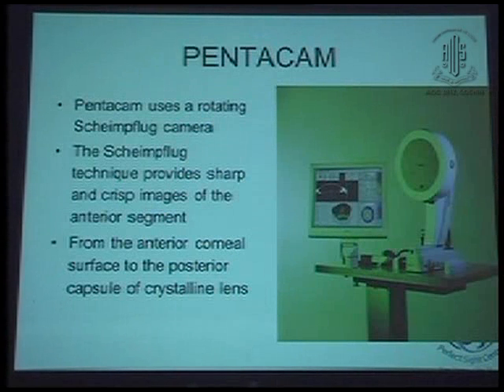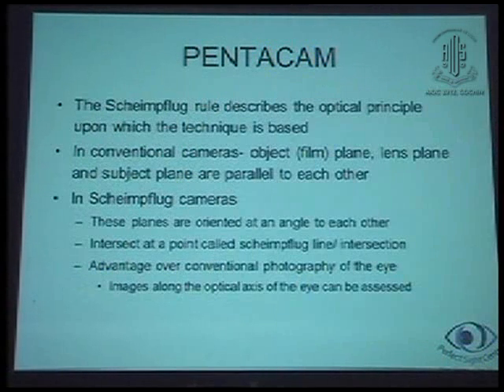Pentacam is basically a relatively newer tool. It uses a rotating Scheimpflug camera. The Scheimpflug technique, we'll just go into that, provides sharp and crisp images of the anterior segment, from the anterior surface of the cornea right to the posterior capsule of the crystalline lens. This rule basically describes the optical principle upon which this device is based.